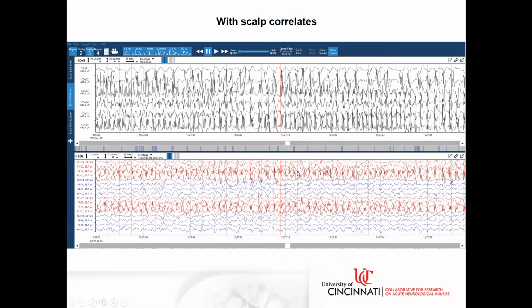So that was a very interesting case, and I think helps illustrate how recording the whole bandwidth and recording things on multiple time scales with multiple filter settings can really provide a much more complete picture. And also having, of course, the intracranial ECoG strip recordings, without which most of this activity wouldn't be seen until it mysteriously appears on the scalp, as now at this point in this patient. Gives you a much greater picture of the full evolution of pathology, and further provides that early warning so that you can begin these interventions before things get too bad, as developed in this case.